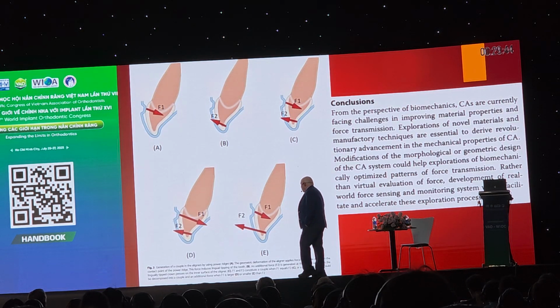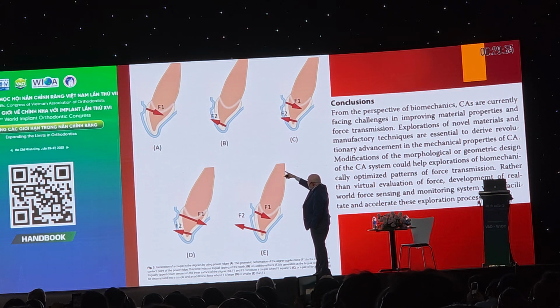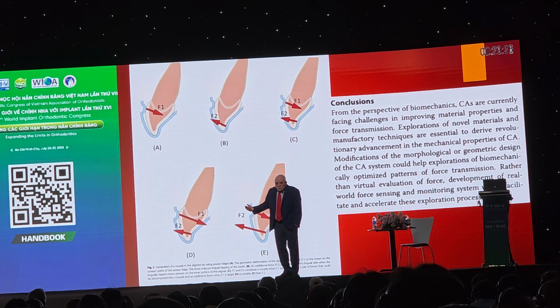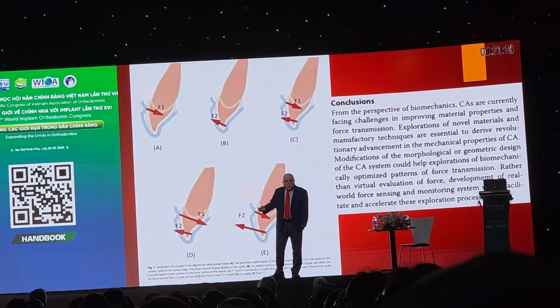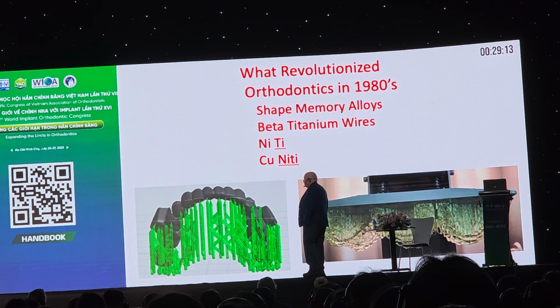So what we are basically looking at are the tooth movements, for example. I'm going to talk totally different here. If you put a dent in your aligner, you can see a line that doesn't fit the tooth in the anterior region completely. Same thing, if you put an attachment, same thing is going to happen, it doesn't fit in completely. And this is why you cannot get a shape memory type of aligner system. Number one, plastic is not very good.